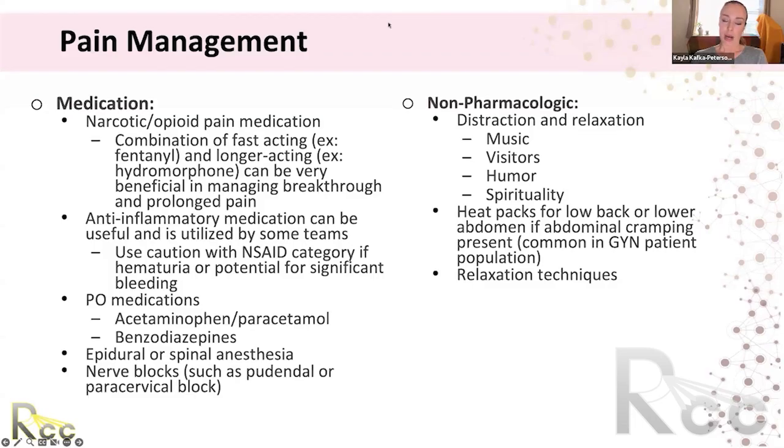We will monitor their labs, and if their white count, especially their absolute neutrophil count, is getting really low, say close to 1 or below 1, we will get them a colony stimulating factor, or their chemotherapy doctor will, to try to get their counts up, because we really want to try not to cancel these patients because their timeline is so critical for treatment to work. When they're with us, the other thing that we do for the actual treatment is they get IV antibiotics during the applicator needle insertion and during their hospital stay to minimize chance of infection.